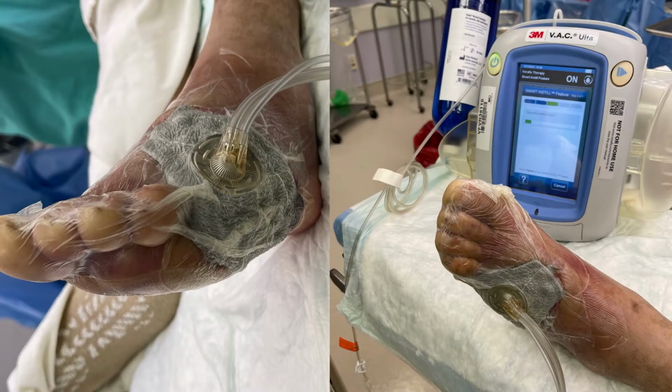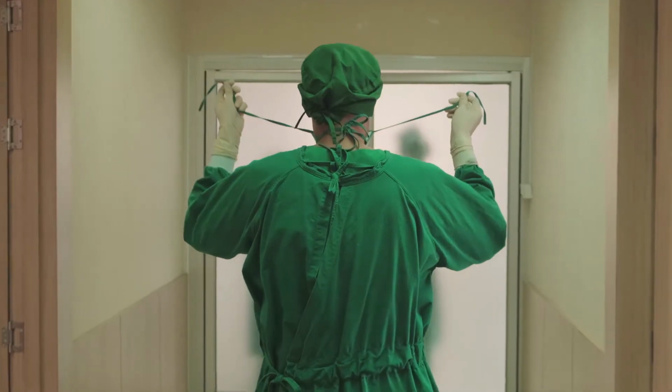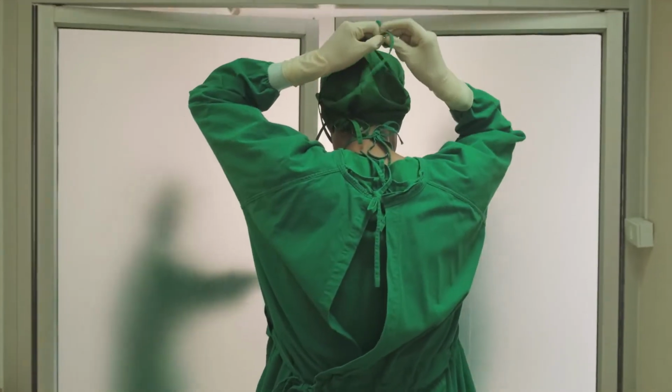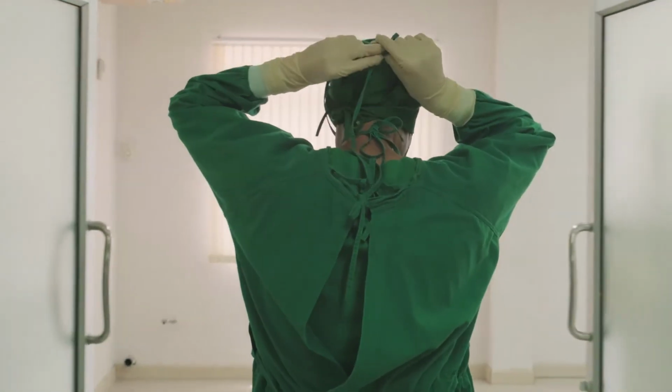Classically, a lot of those patients end up going to the operating room to get their wounds healed, if you will. When we look at that wound, we have to decide how soon is the operation, how deep is the operation, what is the scope of the operation, and how soon we can get them back to who they were, which is the objective for any patient. How can I get back to me?